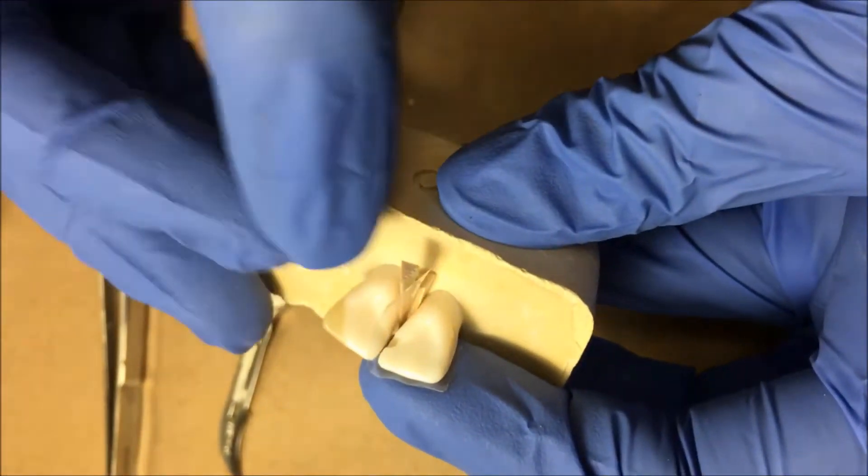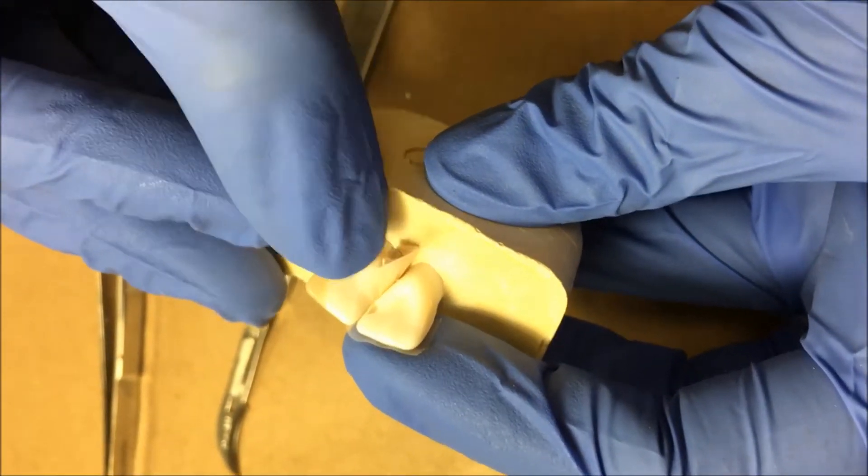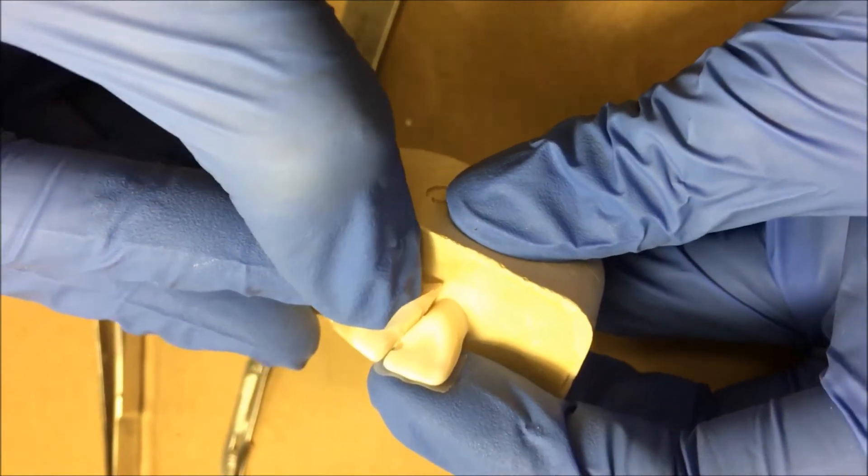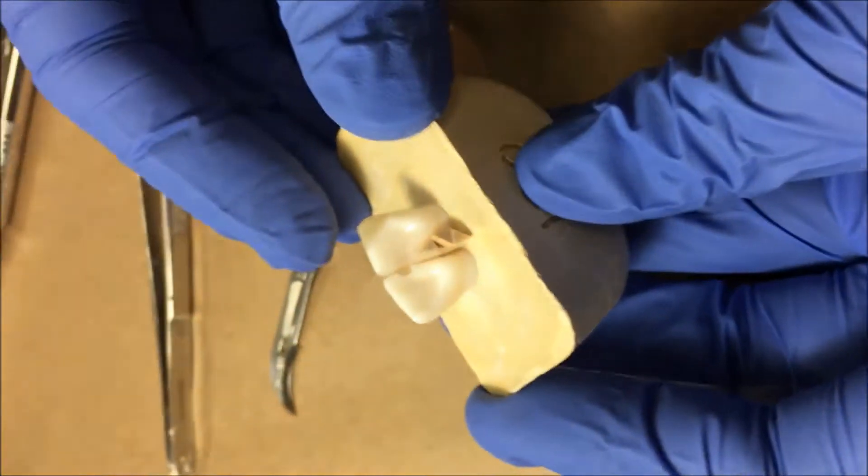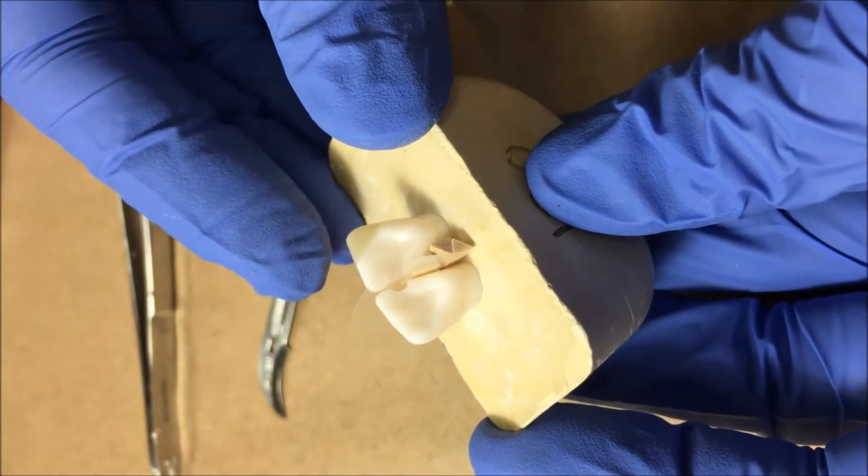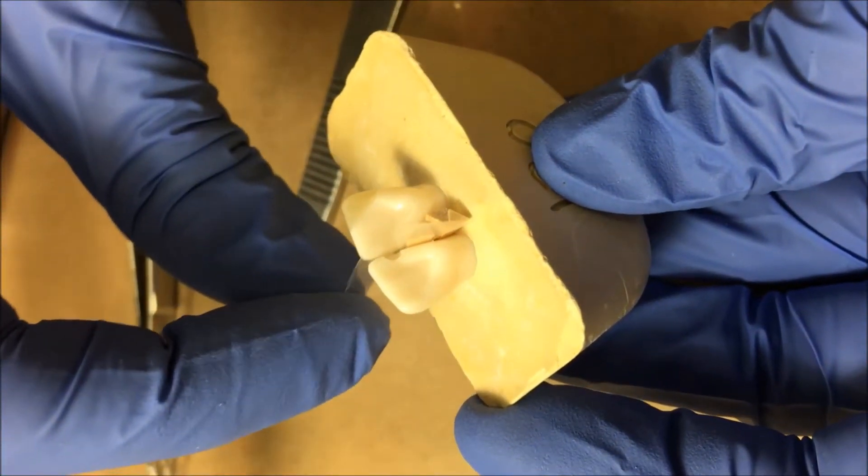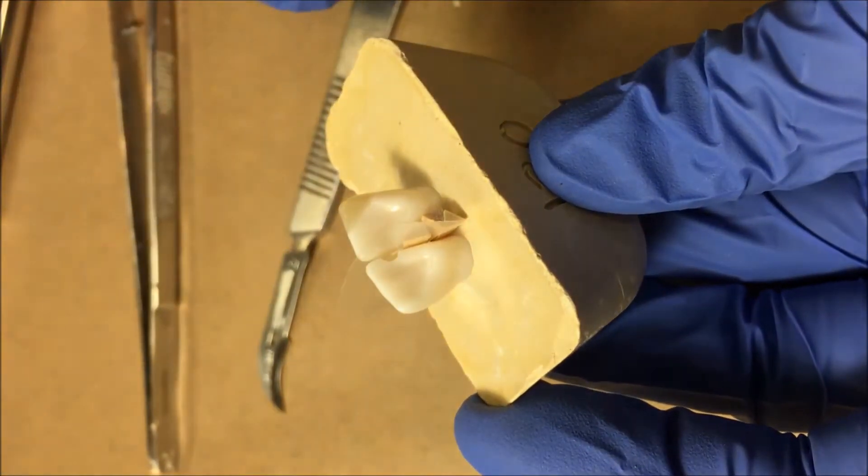So now this last one actually has to be in the correct orientation. I'm going to really push it in there and make sure that it's adapting the matrix to the tooth. The other thing I'm going to check is make sure that I can't pull that out.